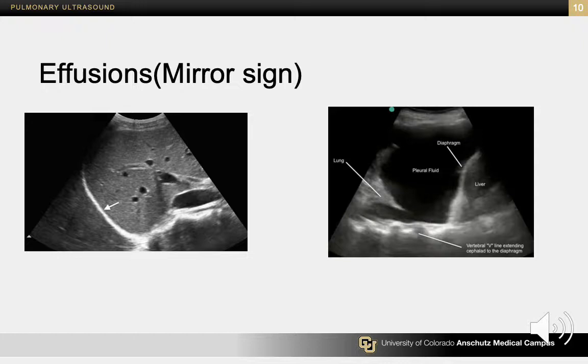And the ultrasound machine isn't super smart, so basically what it thinks happened is that wave just traveled straight down in the original path, and so that's why it's thinking that whatever was after the bounce off the diaphragm is just straight below it. That's giving you that artifact of the liver appearing below, or to the left of, the diaphragm there. So this would be a positive mirror sign. Okay, so that's good. That is normal in appearance.